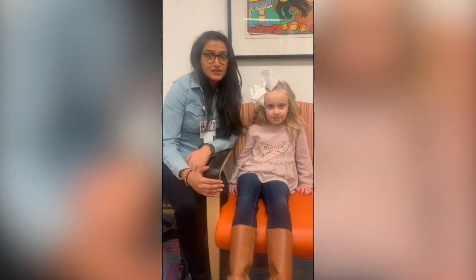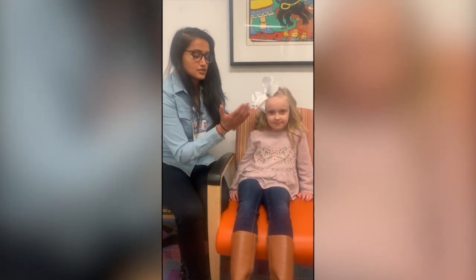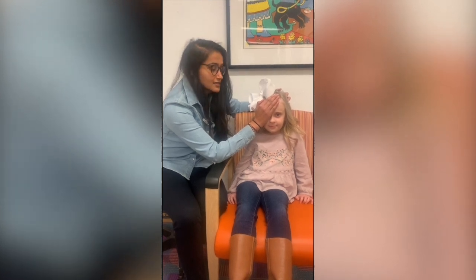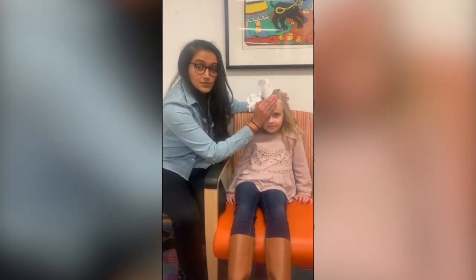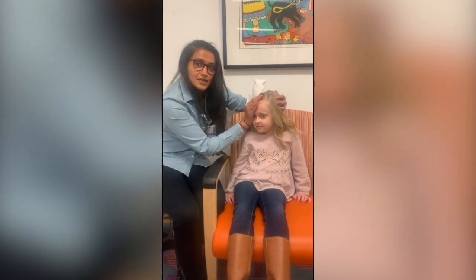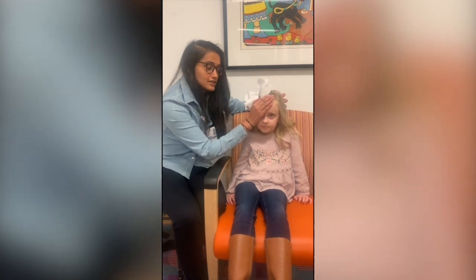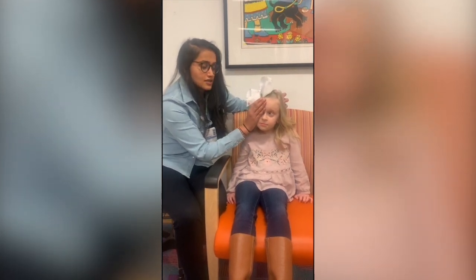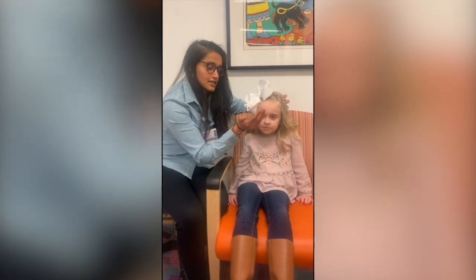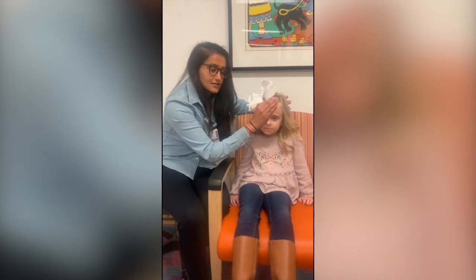When testing your child's vision at home with each eye separately, we need you to cover their eye with the palm of your hand, just like this. We don't want them to be able to peek, so if they're turning their head a little bit this way, they may be able to peek out with their eye, so we want to keep the head straight. We also don't want you to cover the eye with your fingers because they may be able to peek through. So again, just with the palm of your hand, covering the eye that is not being tested.